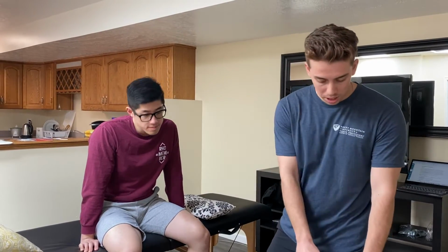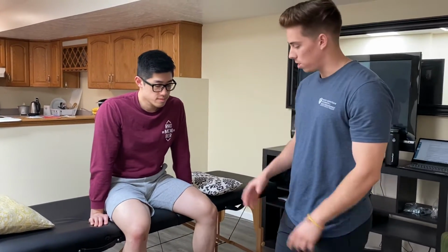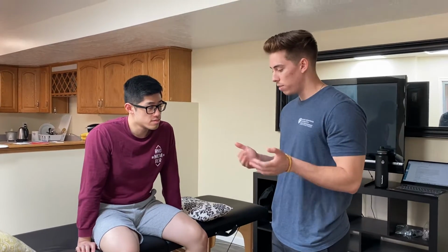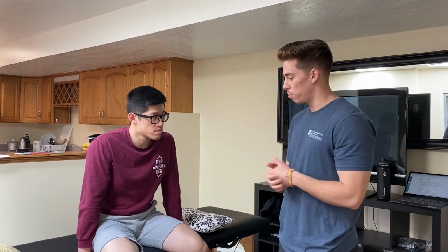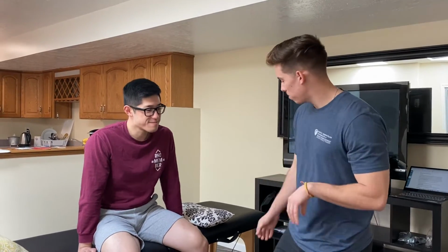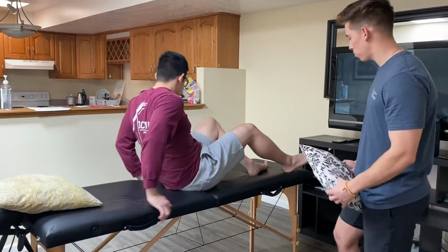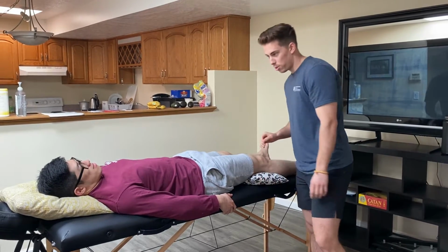Basically I would put these pads just around your knee and turn the intensity up until it's at a comfortable setting. It's just supposed to feel like a relieving vibration. There shouldn't be any discomfort, shouldn't be any twitching or pain with it. Is that something you'd like to try today? Yeah, let's try it. Cool. All right, so let's lay you down here, and I'm just going to put this pillow underneath your knee for a little more comfort. Are you feeling okay?